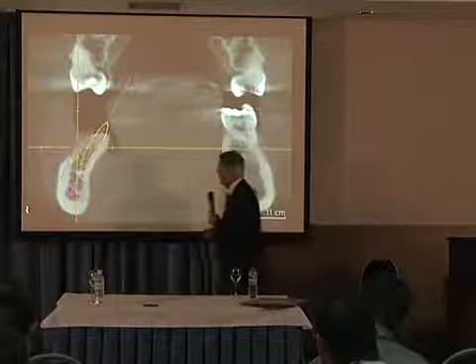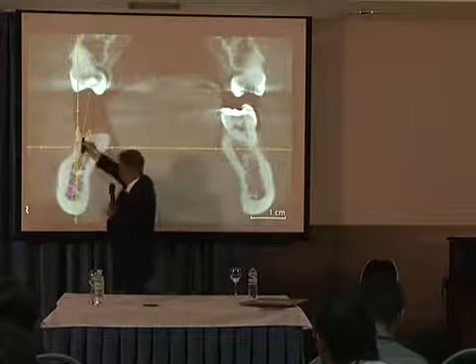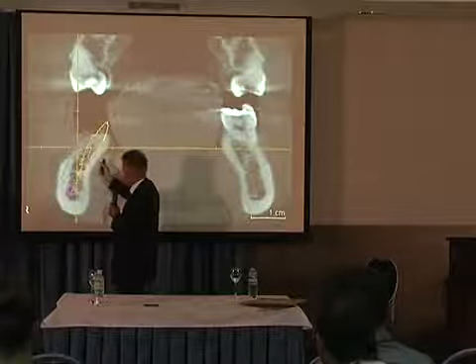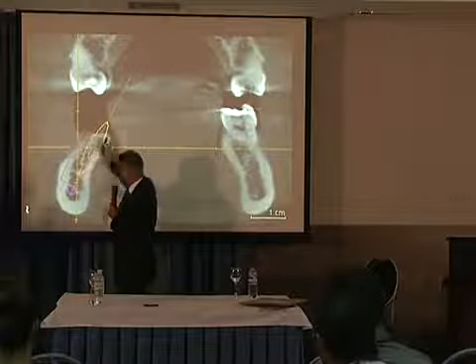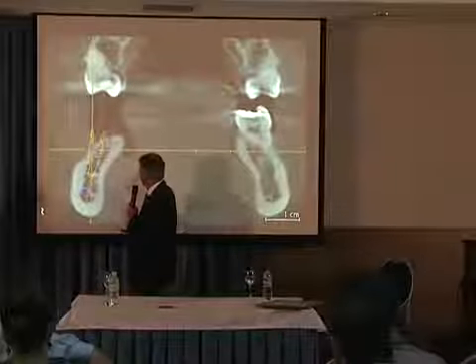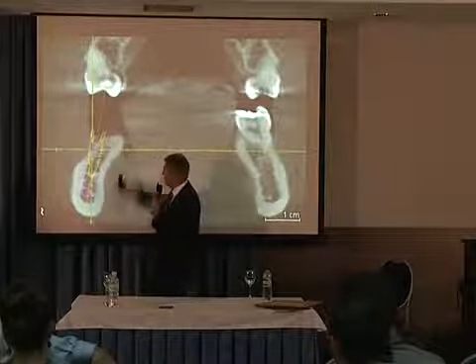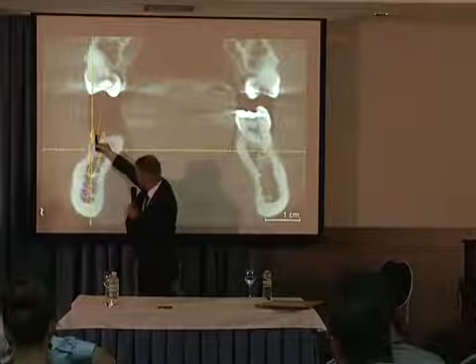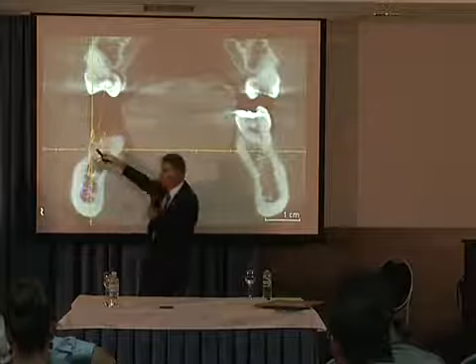So maybe what we want to have is, this is ideal. This is идеальное положение. Sorry? This is very poor, this position. Да, эта позиция явно нас не устраивает. Вот это считается идеальная позиция. This is ideal, and what we want to have is place our implant like this. Если бы мы захотели, lateral augmentation.